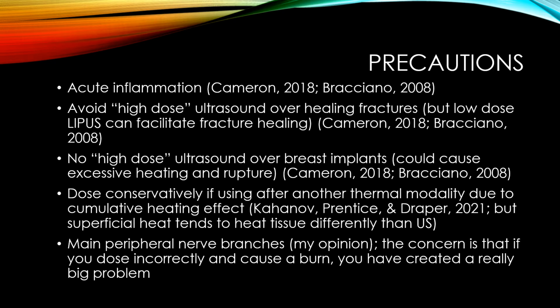Remember, ultrasound is a conversion modality. Basically, you're just pouring energy into the tissues where that energy is then converted to heat. Ultrasound doesn't care what temperature the tissues start at, they'll just make it hotter. So that's why you want to be very careful if you're using it after another thermal modality. The caveat to that is that superficial heat tends to heat tissue differently than ultrasound does.